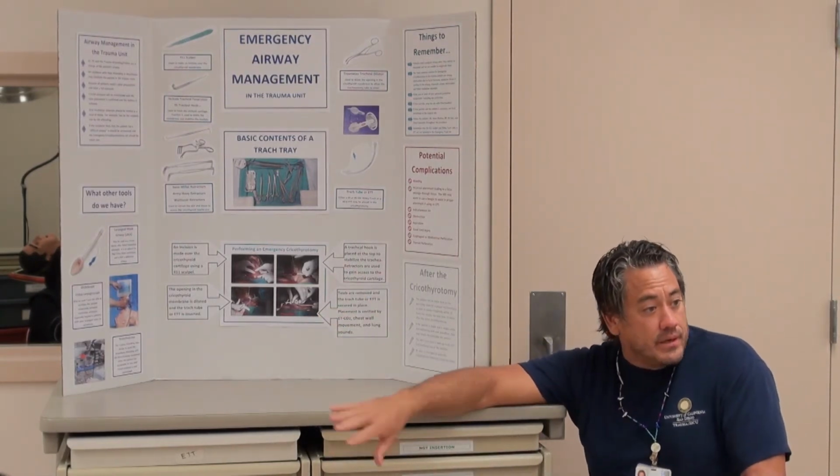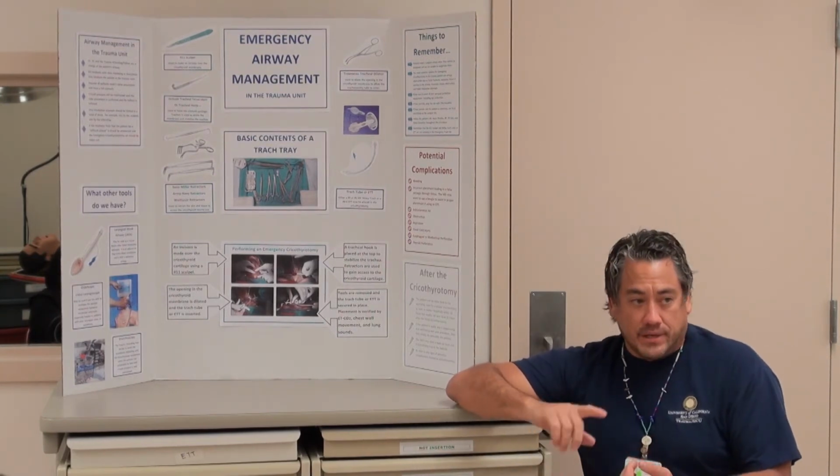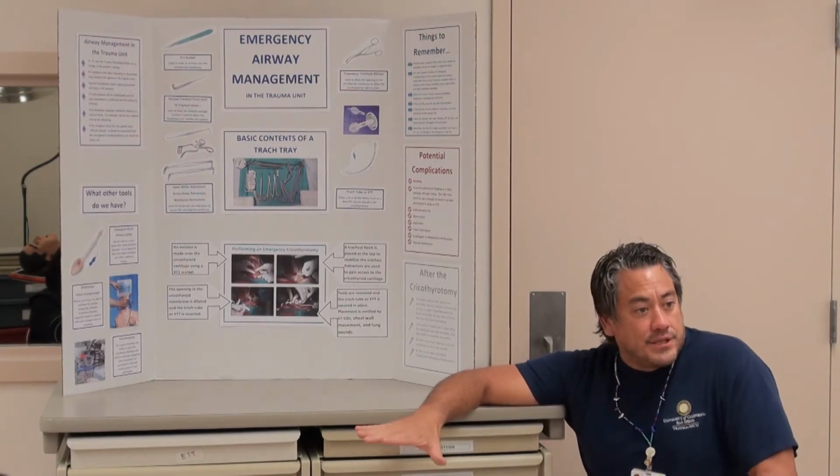And then you check placement. Just like you do with anything else, you need to check your end-tidal CO2, you need to look for the rise and fall of the chest, and you need to check the lung sounds.